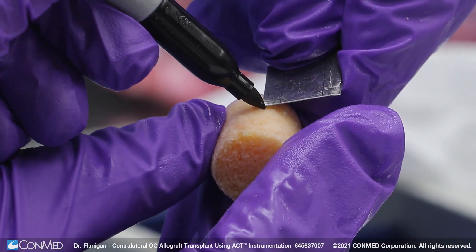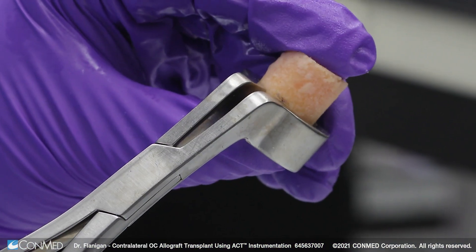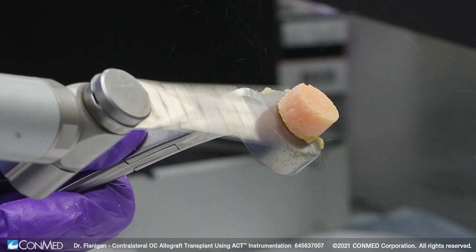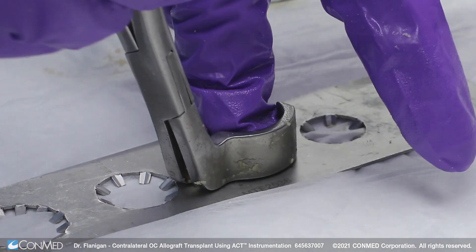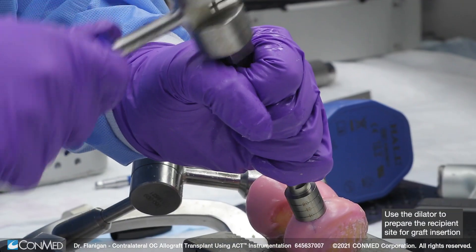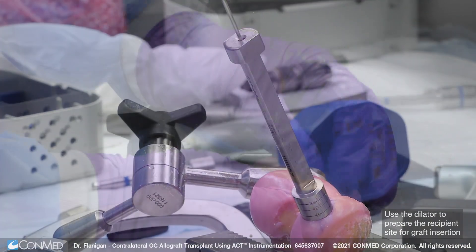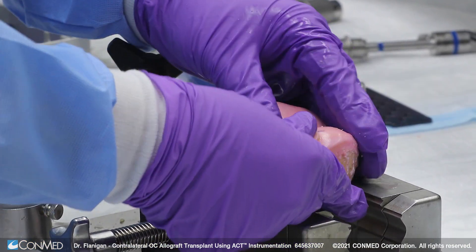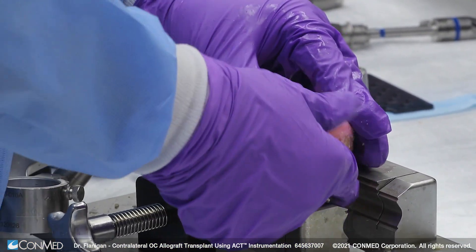Transfer the depth markings to the graft. Place the graft in the graft forceps, matching up the markings that you have just made to make the perfect size. Chamfer the graft to help with graft insertion. Now you're going to want to match up the 12 o'clock positions of both the recipient and the donor, and then use finger pressure to implant the graft into the knee as a press fit.